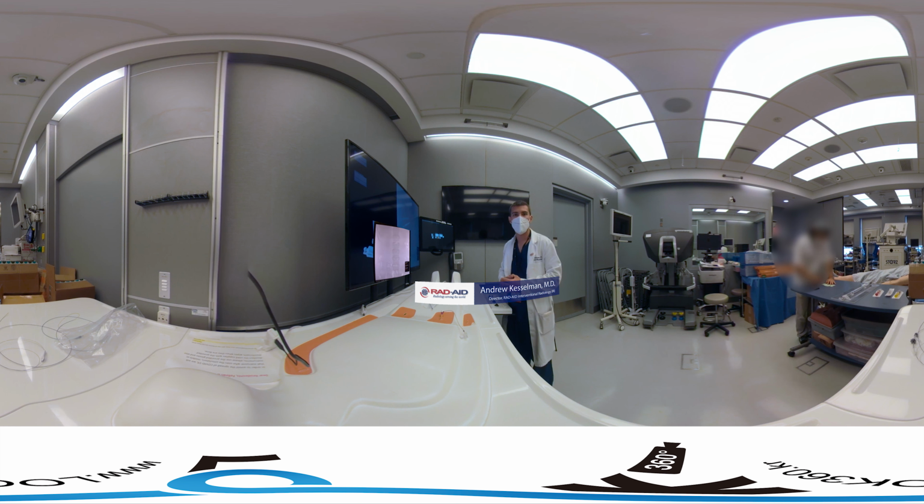All right, so maybe we'll do an injection from here. What I'm going to do is I'm going to do obliquity. And on this side, we're going to do an LAO, see if that opens up anything. Let's fluoro right there. And let's do a DSA now. And there you can see a nice injection. You can see the uterine artery coming off as that first arterial branch, again supplying the uterus there.